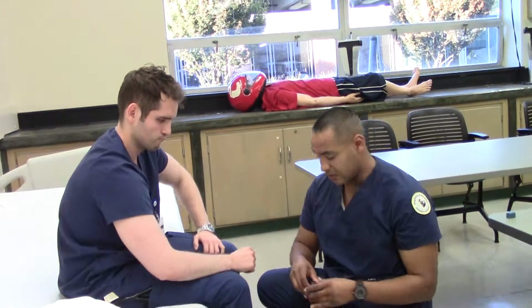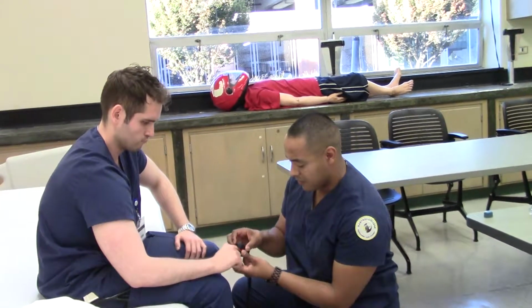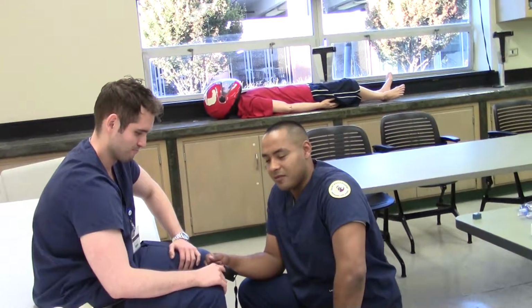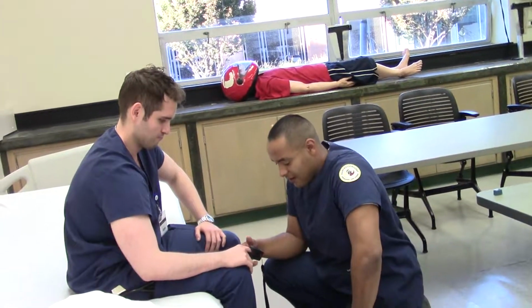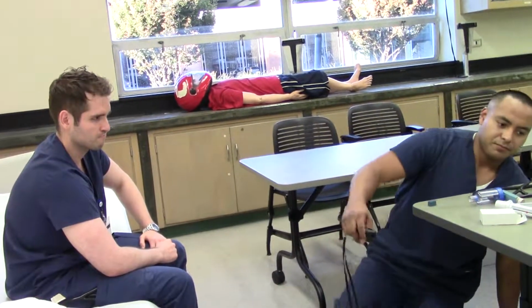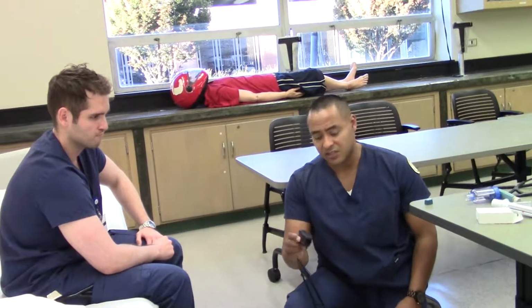I'll get the pulse ox. I'm sure the pulse ox is pretty good too. The patient's skin color looks good. He has no nail polish or anything like that, so the pulse ox can get a good reading. Cool. Patient was at 98. That's pretty good. He's healthy. His pulse was identical to my reading, so this device works well.